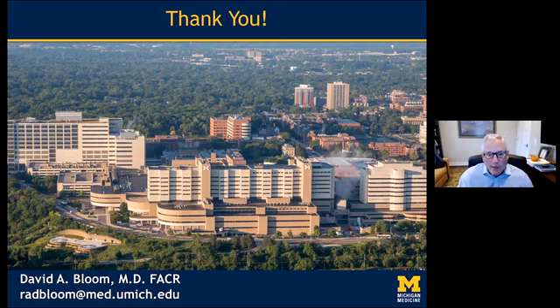Which pediatric abdominal tumor with peritoneal seeding do you see more commonly? The one that we see most commonly, I would think, is probably rhabdomyosarcoma. I have seen a couple of cases where lymphoma has done that as well. I would like to point out, I didn't mention this earlier, I think diffusion weighted imaging is a great tool for this. And that's why we always do it as part of our abdominal tumor imaging. And most of our abdominal protocols include it typically.